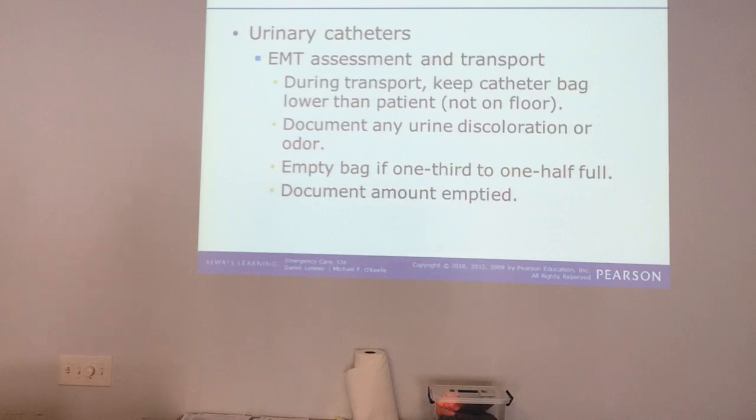Okay. During transport, keep the catheter bag lower than the patient, but not on the floor. Document discoloration or odor. If that urine smells like the worst thing you've ever smelled in your life, and it's cloudy or, you know, chunky or dark brown, they have a UTI about guaranteed. Empty the bag if it's one-third to one-half full. That's a really good job for somebody who works at a hospital. I do not empty these because I don't have anything really to empty them into. And document how much you empty if you do.